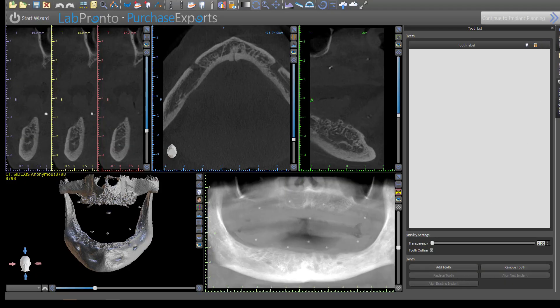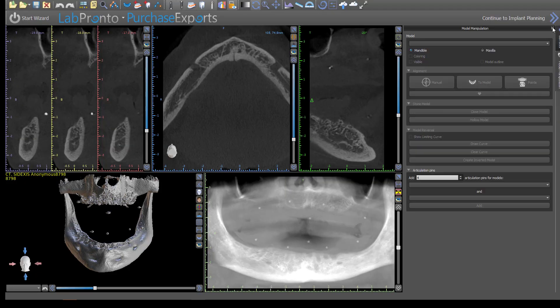Hey, this is Dr. Cory Glenn and I thought I'd make a quick video going over how to evaluate for an anterior loop. This is something that comes up quite often in the courses I give on guided surgery. As we're going through cone beams, people will see little branches coming off the mandibular canal. They get confused — is that an anterior loop? Is it the incisive canal? This is one of the cases we do in that course and it really demonstrates this very well.